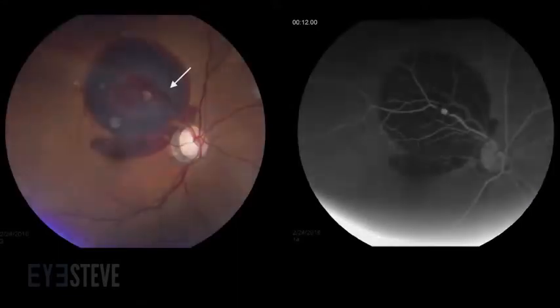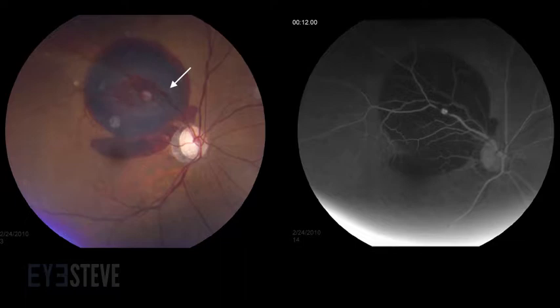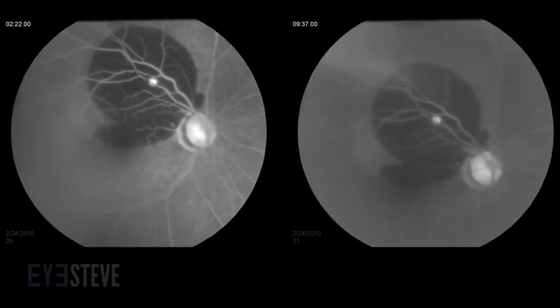A fluorescein angiogram was performed, but unfortunately did not clearly photograph the macroaneurysm. With that in mind, let me show you some wonderful FA photos of RAMA from the University of Iowa. Here you can see a fundus photo showing a large area of subretinal hemorrhage, with hemorrhage extending into the macula, and a small amount of pre-retinal hemorrhage as well. Notice the white spot along the supratemporal artery, which corresponds to the hyperfluorescent lesion on the angiogram. Here, in the mid-venous phase, there is increased hyperfluorescence, which persists a little bit later.